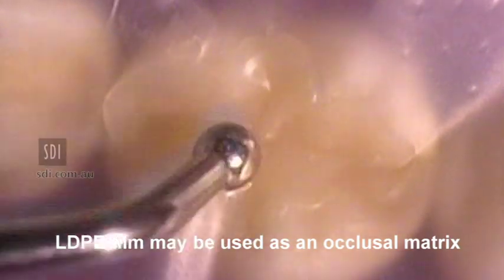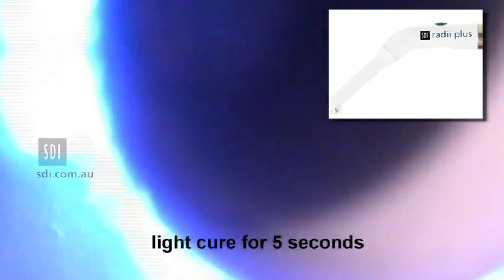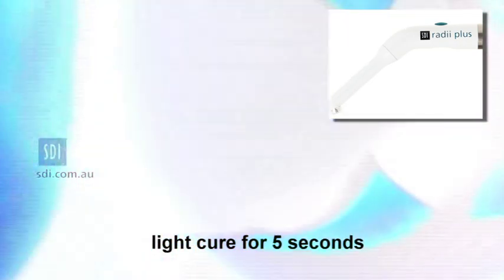Or if not using rubber dam, use the film as an occlusal matrix. Light cure the preparation for 5 seconds, then remove the plastic film.